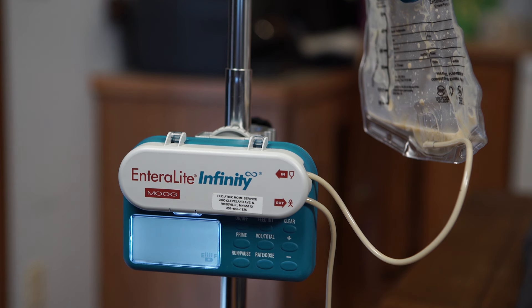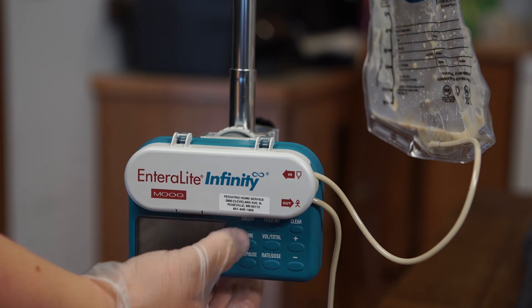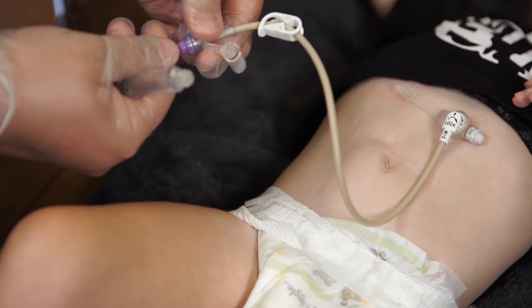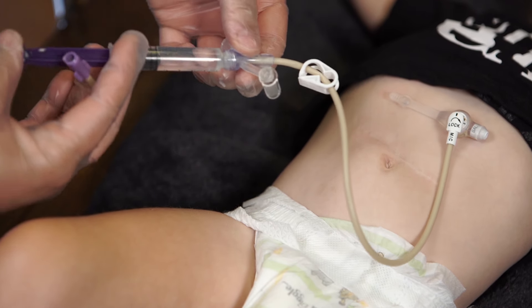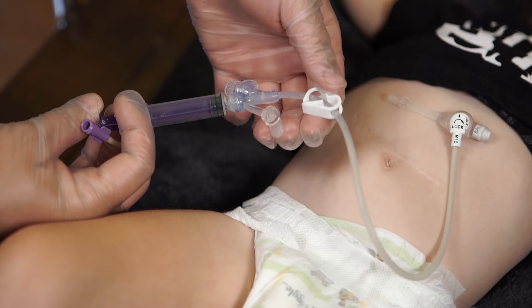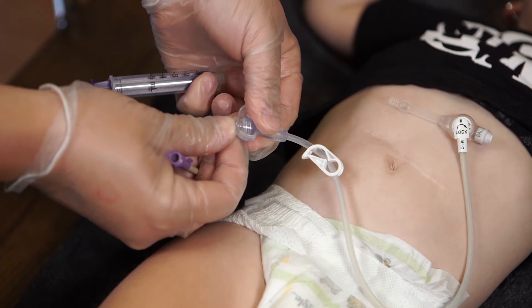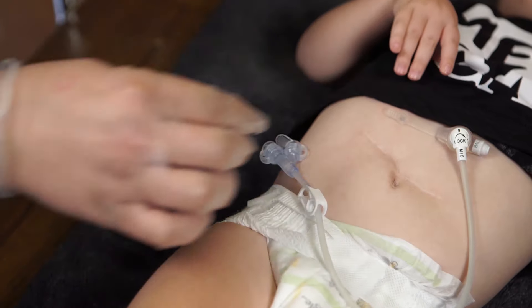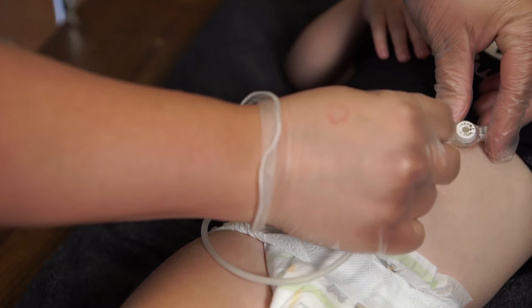Silence the alarm and turn the food pump off. Clamp the feeding tube and extension and disconnect the feeding bag. Flush the feeding tube with the prescribed amount of water. If you're using a low-profile feeding tube, disconnect the extension and close the feeding tube cap.